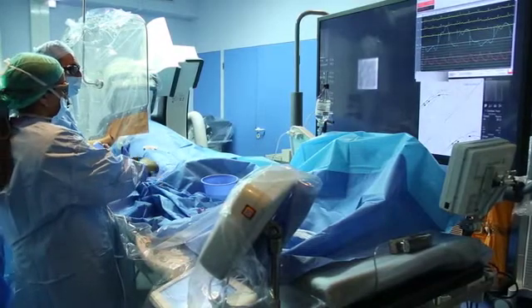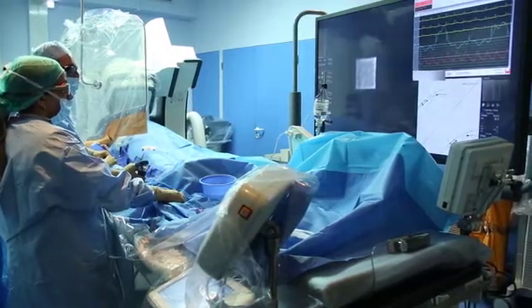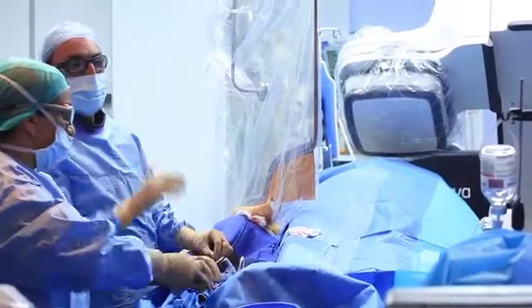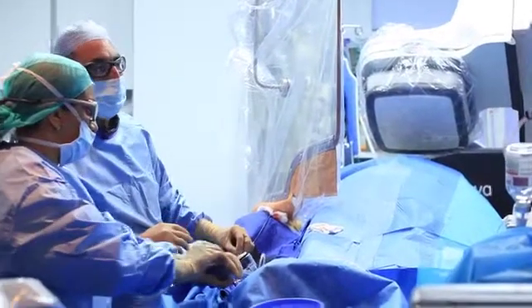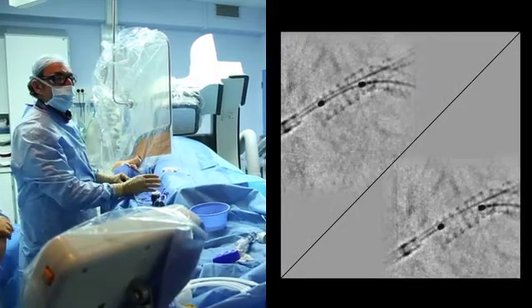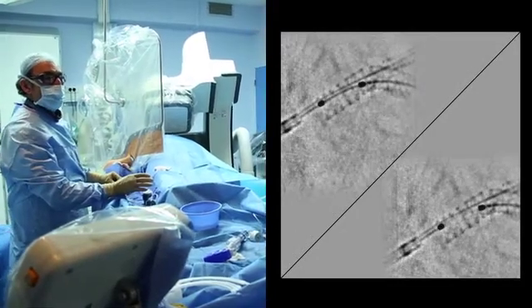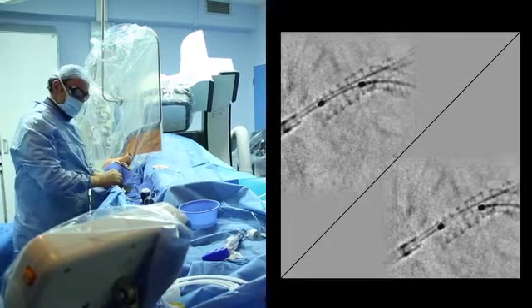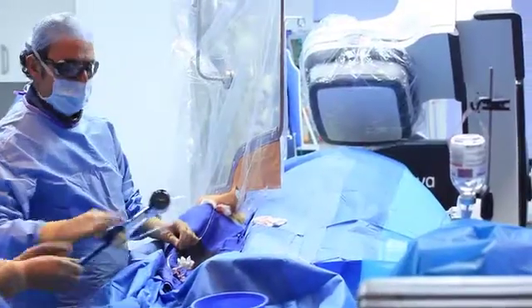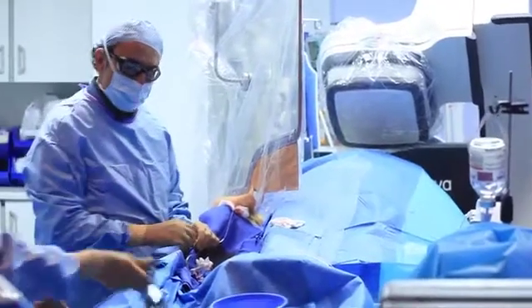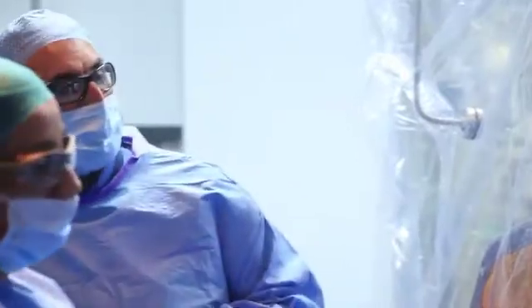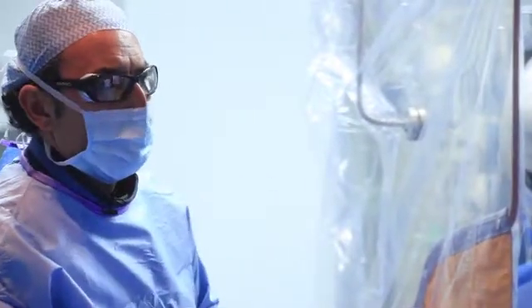Remove the guiding catheter and do now the POT on the ostium of the left main. That's really a good image of the result — the stent is very well open as you can see here, including the proximal part of the stent and the ostium of the left main. That's an important thing — to well open the stents.